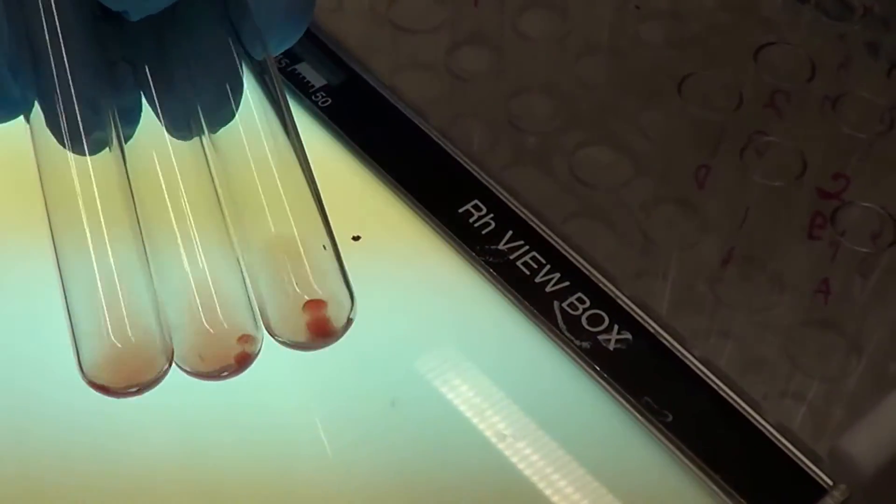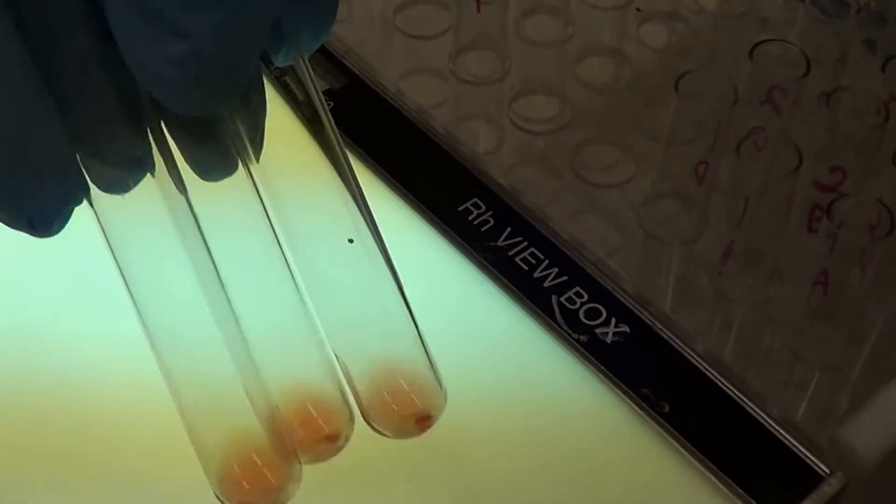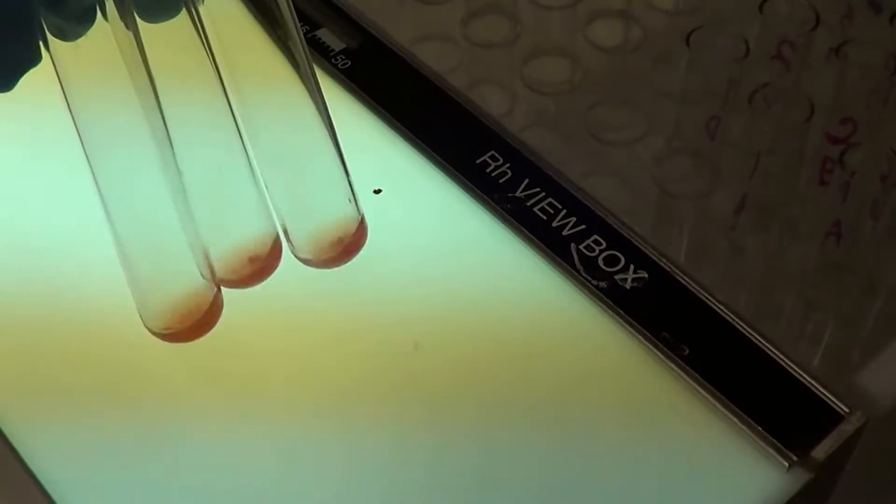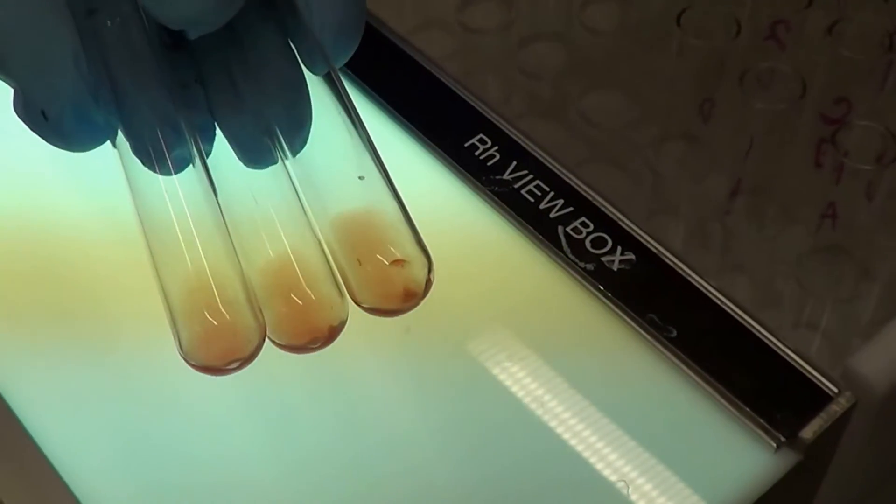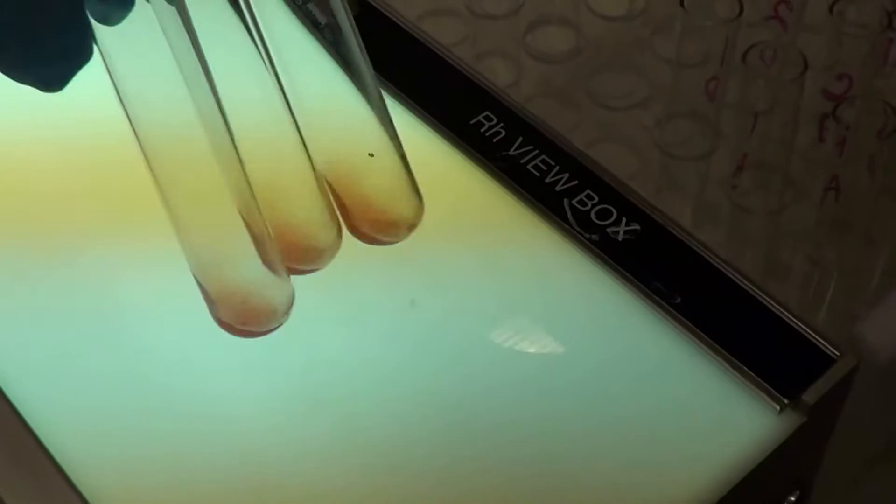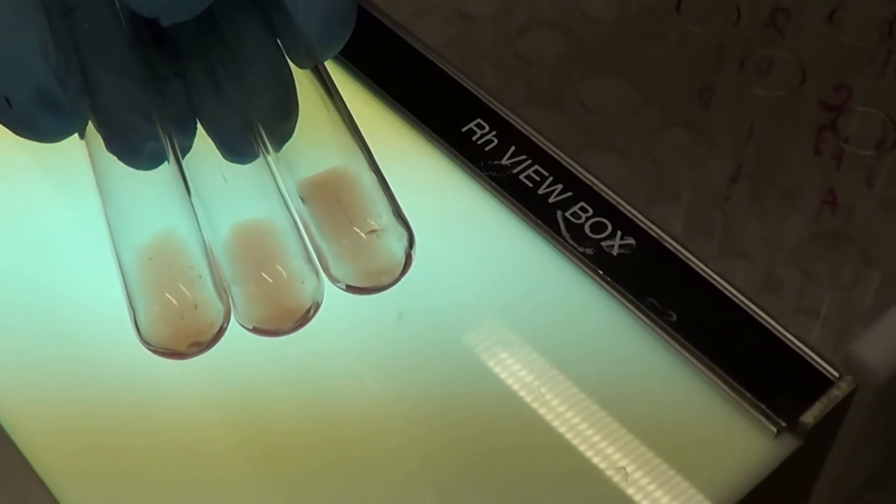There are no positive reactions in these test tubes. That means the patient's serum does not have any antibody to any red cell reagents or any red cell antigens.